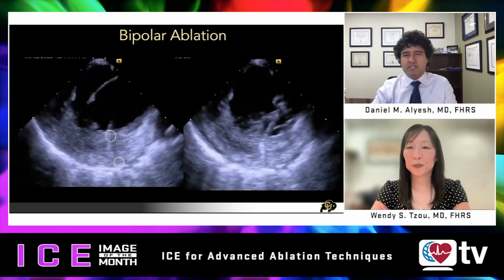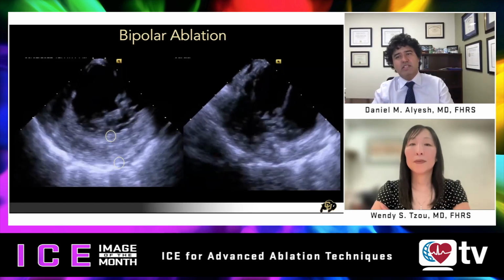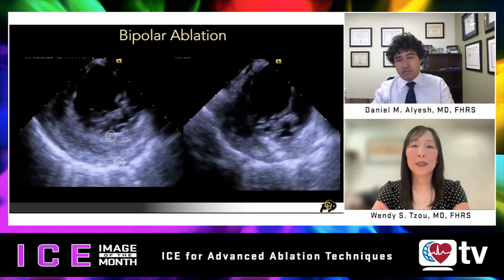And it's really amazing to see how the edema does extend transmurally in this circumstance, like it does many times with bipolar ablations. Question for you about active and passive catheter. What do you do in this circumstance?